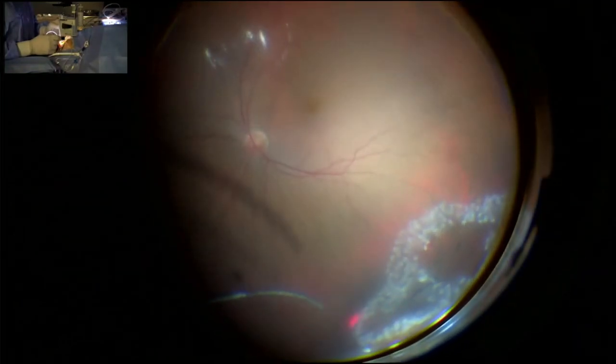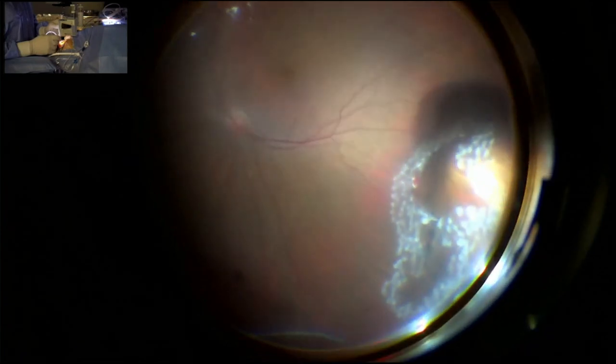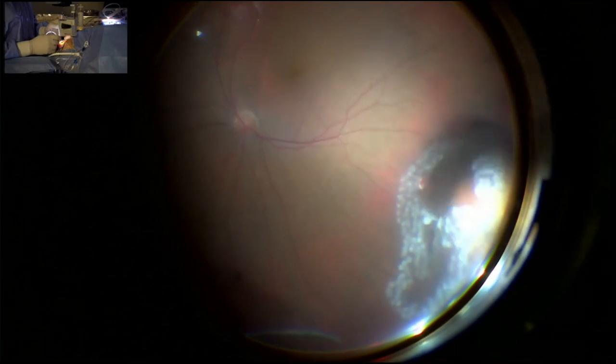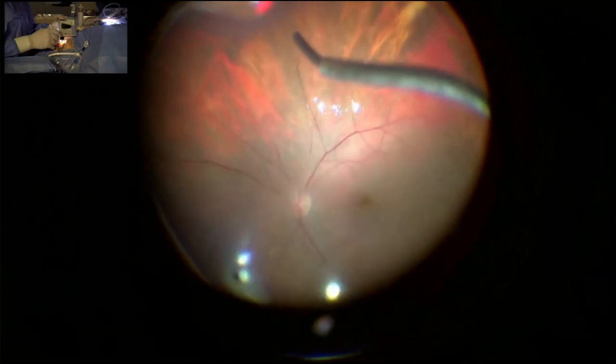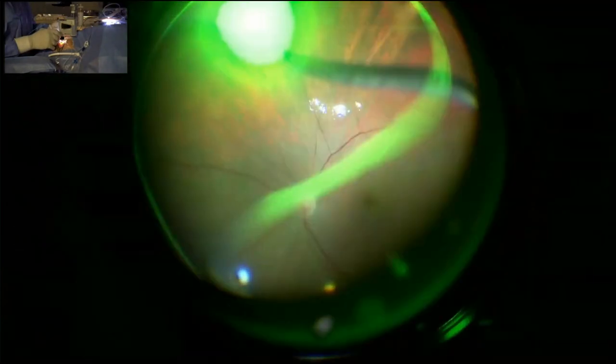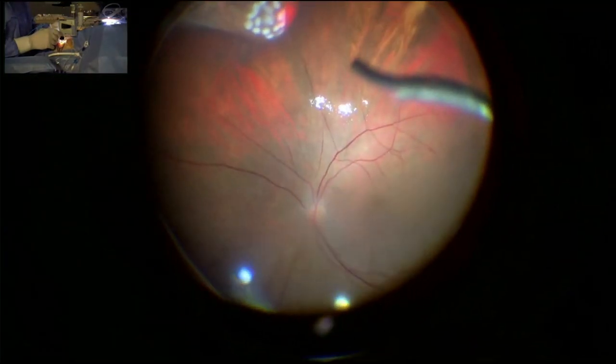Okay, so as you see, I think you can see clearly the retinal tear, and we did laser all around the retinal tear, and there is no laser necessary in this area, and this amount of laser is enough. Remember this area that I marked, there was a small retinal tear, and I will do laser again in just this area, and the other part of the peripheral retina is stable, there is no retinal tear. This is the other part.